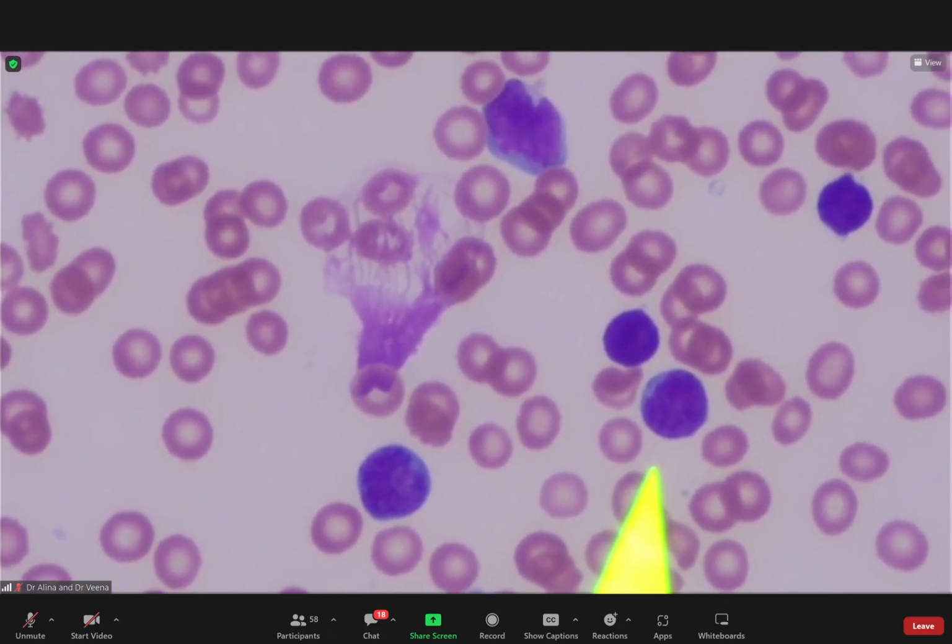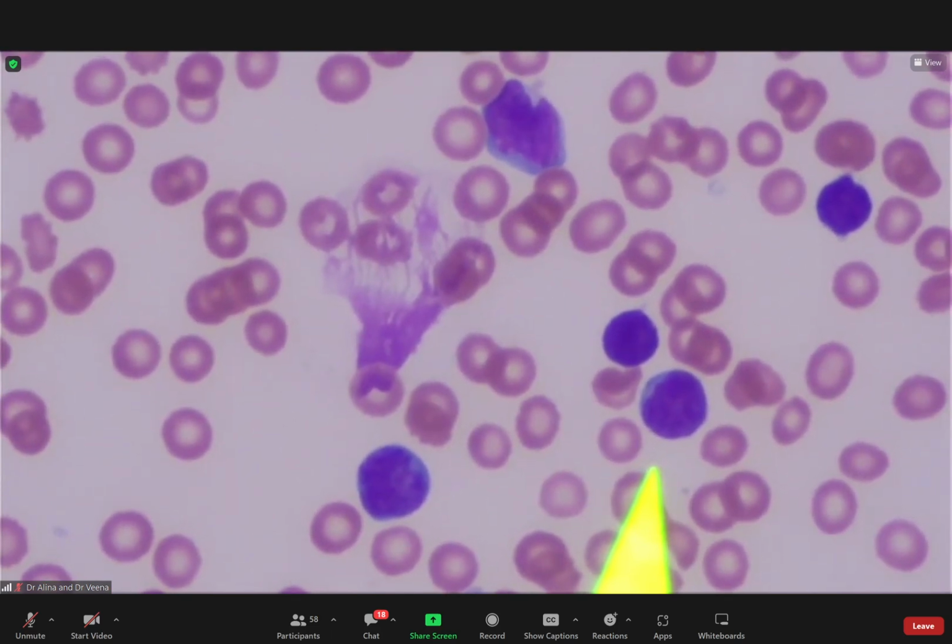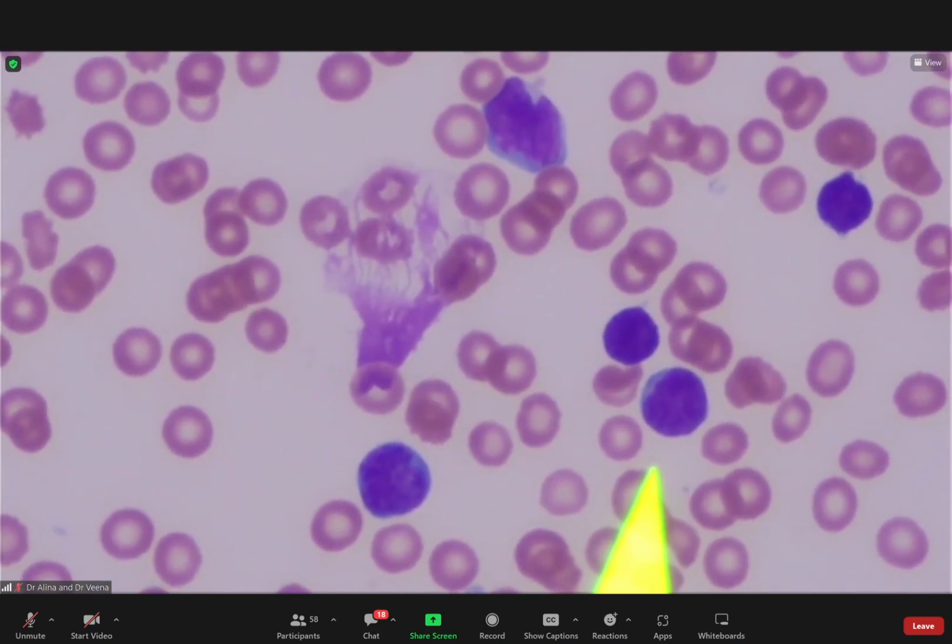There's nothing wrong because it's quite clear that it is a lymphoblast. There's no business for blasts to be in the peripheral circulation at this magnitude, at this level, the count is so high, right? If you have a blast count that is so high and your flow cytometry says that these are blasts, then that's acute lymphoblastic leukemia. It can't be anything else.